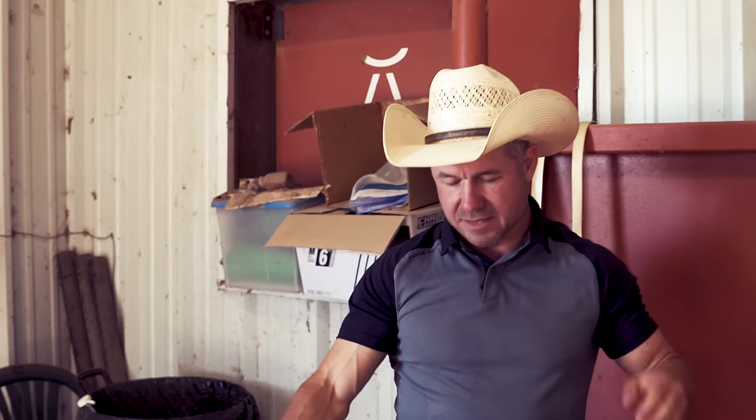The problem with two dominant follicles like that, when it's the first cycle of the year, a lot of times they'll have those. And if both of them were to ovulate, and we're not flushing embryos out of this mare, she could have twins. And then you get an issue, I'll have to pinch one of the embryos off if she has twin embryos, because they can't carry twins. So that's an issue I've got to deal with.